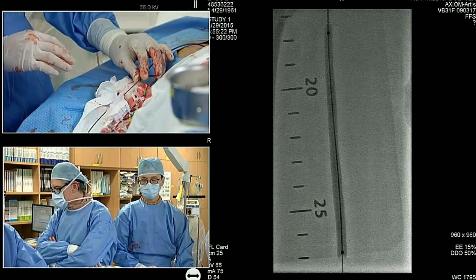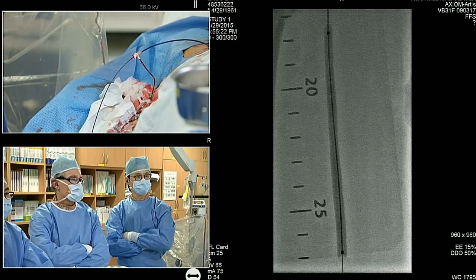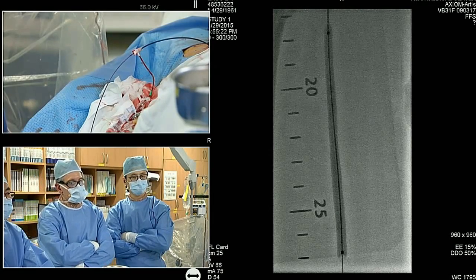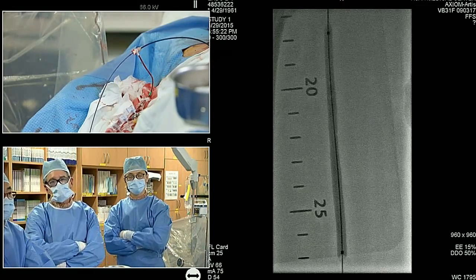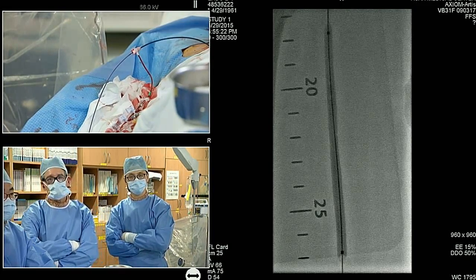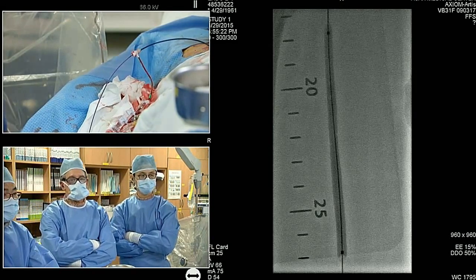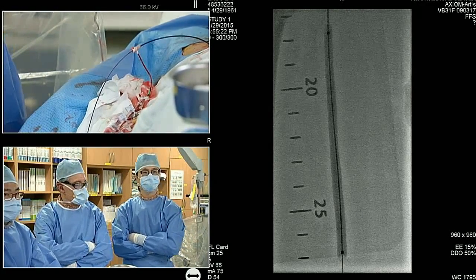So, Dr. Bersin, could you tell me the reason you exchanged the guide wire from 014 to 035? Well, it just makes it easier to deliver. These are 035 balloons, and I think we would just struggle more. In the interest of time, we just did that, so it'd be much more efficient to deliver. And then especially if we're going to do a silver PTX at the origin, it's really helpful to have an 035 wire.